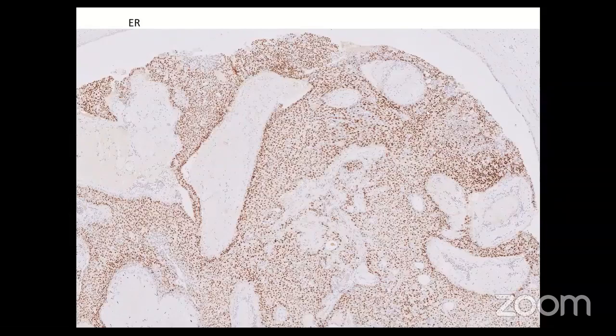On estrogen receptor immunostaining, the epithelial population in this area shows diffuse, consistent nuclear reactivity, supporting a clonal process, and if this area measures at least 3 millimeters or larger, one would render the diagnosis of a low-grade DCIS within an intraductal papilloma.